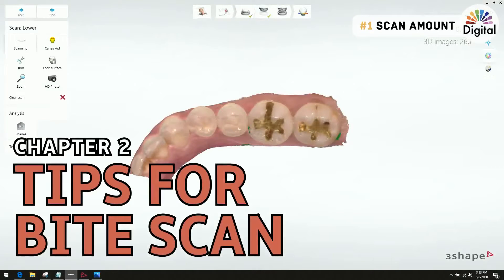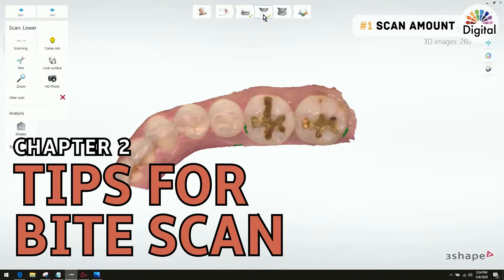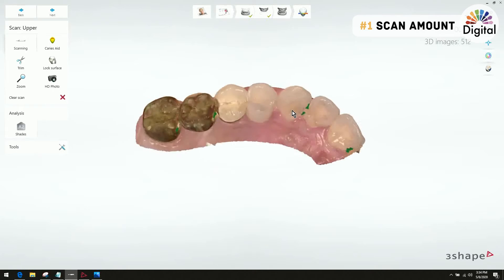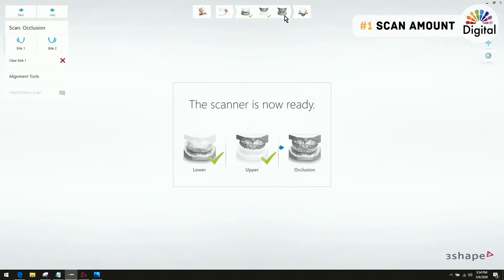Welcome to 3Shape Trios software. I already scanned the lower half arch and got the upper half size, so now it's time to scan the bite scan. Let me scan the bite right now.